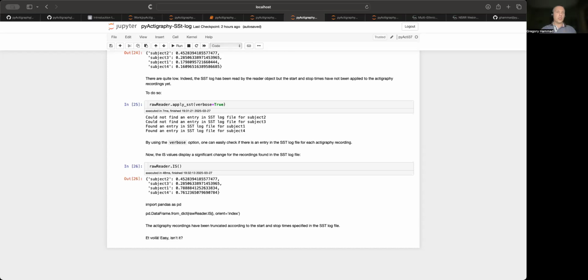Maybe what you should do is try to get what you want and detect the differences yourself visually on a subset of your cohort, and then run the algorithm. Then you should tune the parameters of your algorithm so that it matches what you expect. Then you see on a small other sample if the testing is successful, and then you can maybe run it on the full cohort. So it's the classical validation of a training set and then a test set.